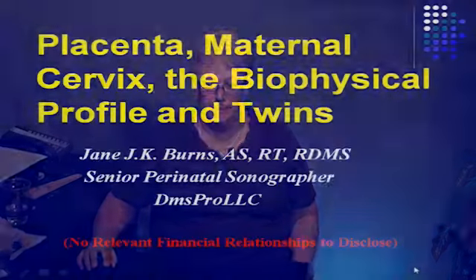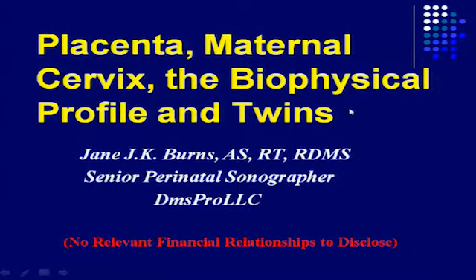All right, we're going to go into part 2. Talk about the placenta, the maternal cervix, biophysical profiles, and then some twins.